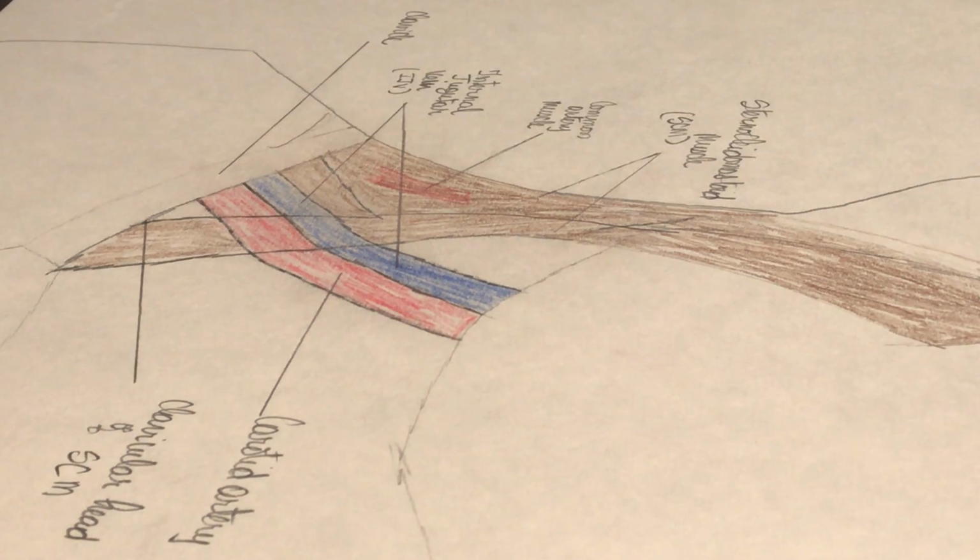The absolute contraindications are infection over the site of placement, existence of venous thrombosis in the target vessel, pathologic conditions such as superior vena cava syndrome, and patient allergy to the impregnated catheter antibiotic.